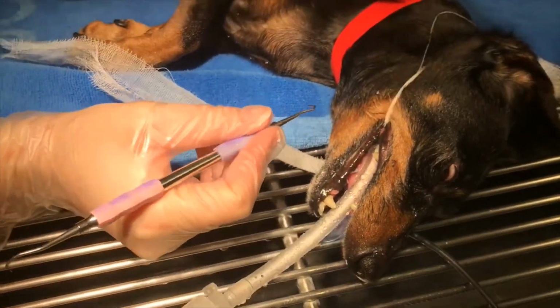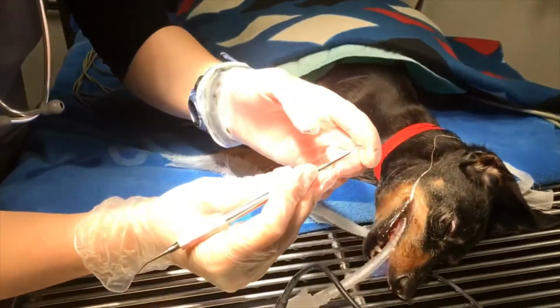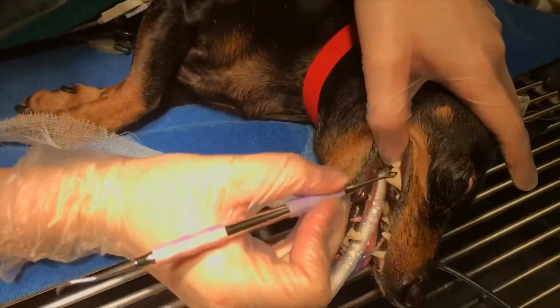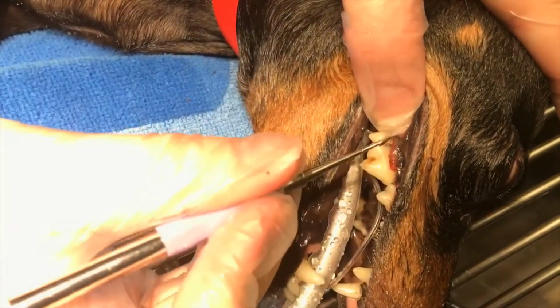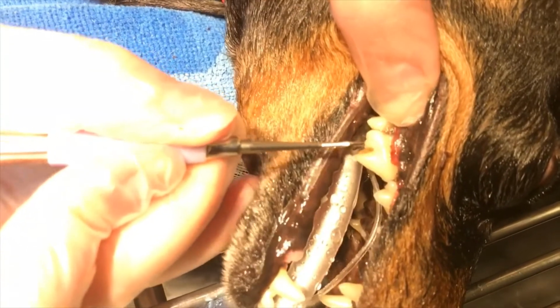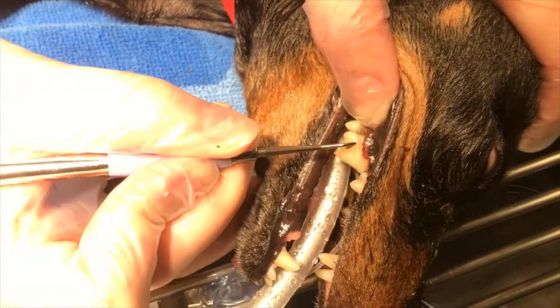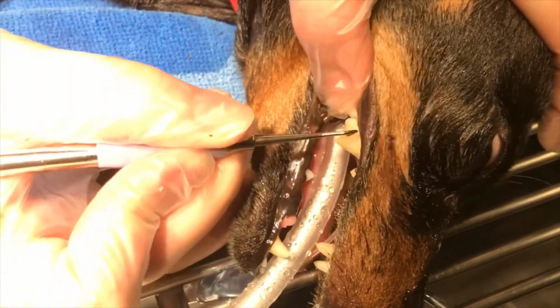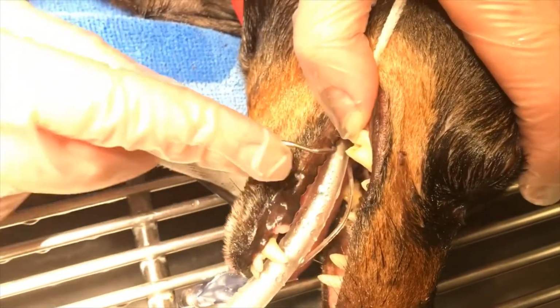Alright, so I'm also going to demonstrate some manual hand scaling. Here I do have my manual hand scaler that I can use. For this one, it's good for these grooves in here with this chunk of tartar. You might not be able to get in there with the ultrasonic scaler. I'm going to apply even but firm pressure, and I can drag it towards me. You do want to be careful of the gum lines, as you would cause damage to the gums if you snag the edge.